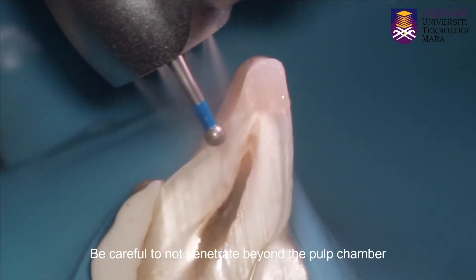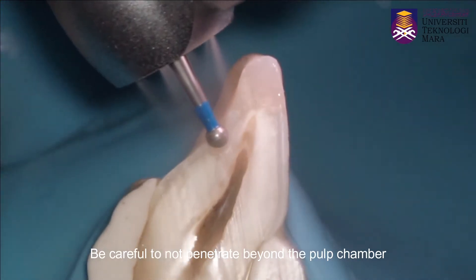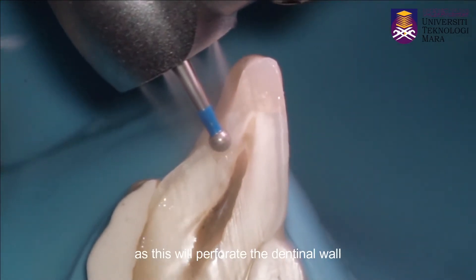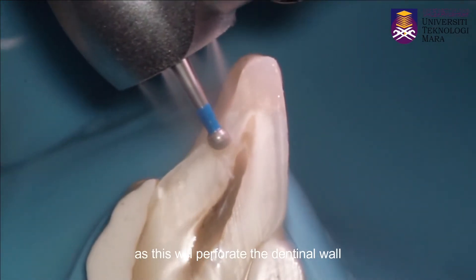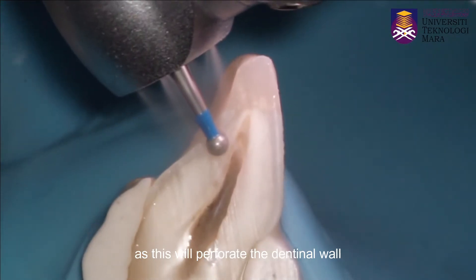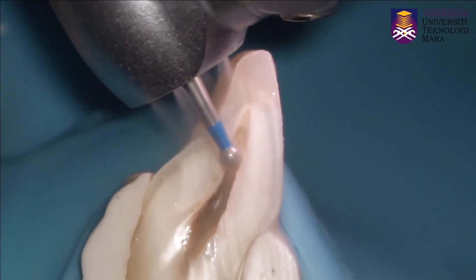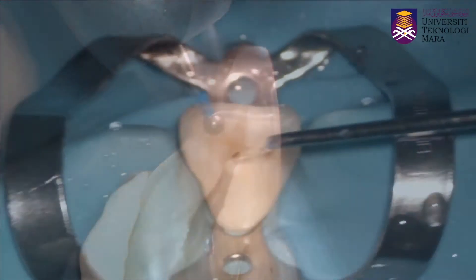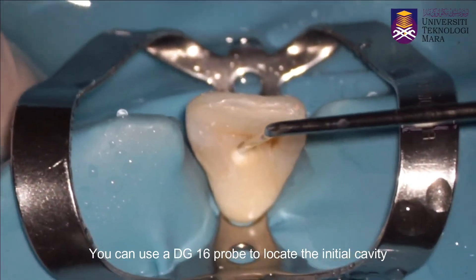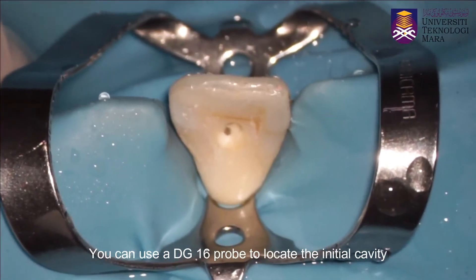Be careful not to penetrate beyond the pulp chamber, as this will perforate the dentinal wall. You can use a DG16 to locate the initial cavity.